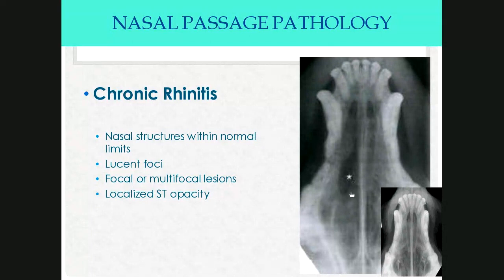And this was an example of fungal rhinitis. So aspergillus tends to be very lytic, leaving an almost empty nasal appearance. Other causes of rhinitis might be allergic, hyperplastic, infectious, foreign body associated, or secondary to dental disease. The classification of chronic rhinitis occurs when inflammation is severe enough to cause structural changes in the mucosa that compromise the immune function.